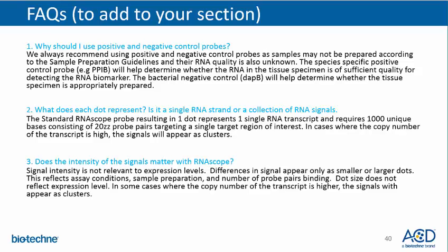And this relates to their storage, for instance, to how they are fixed, and also the thickness of the sections. What is also important is that all samples pass quality control, which we talked about before, being the positive and negative control probes. In that case, when all of this is okay, RNAscope will offer absolute readouts or numbers, and these represent the number of transcripts.